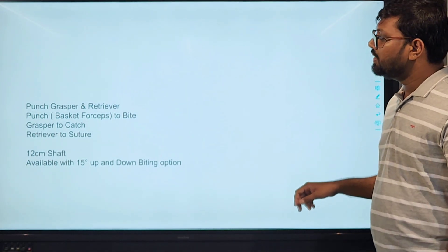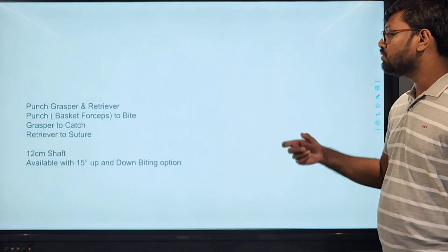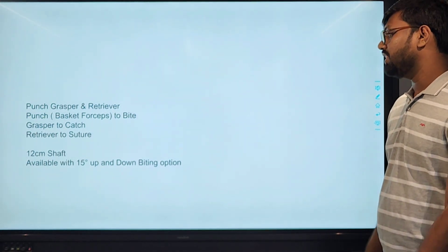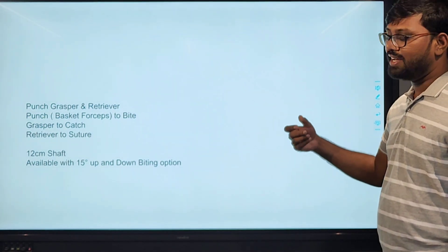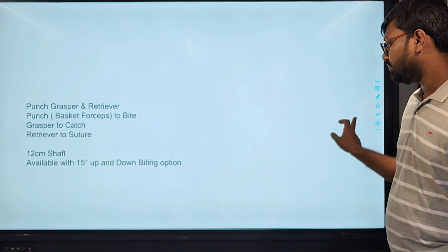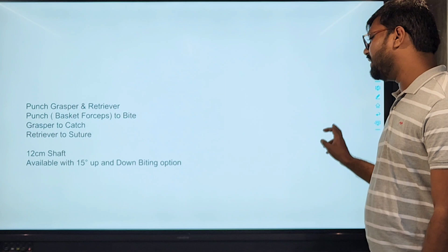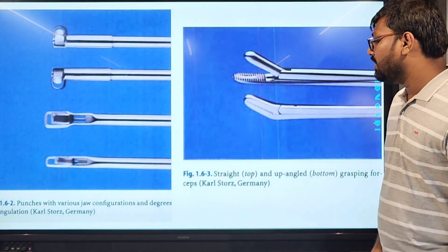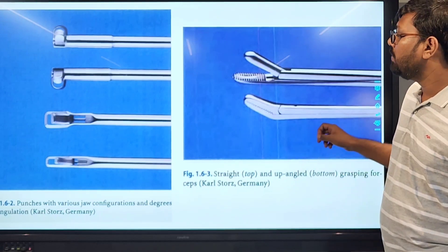Various instruments: there are graspers and retrievers, and biters to cut the degenerated tissue, graspers to catch it, and a suture retriever. They are available in 15-degree biting positions. These are the punches — various sizes of up-biting and down-biting punches. These are straight and curved angle graspers.